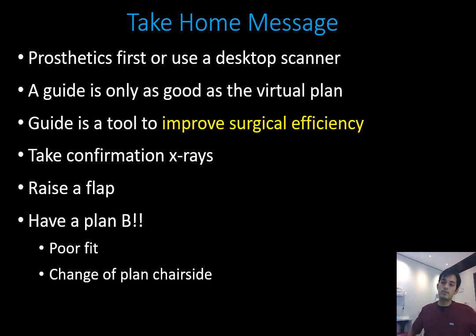Secondly, a guide is only as good as the virtual plan. Any shortcomings in your implant simulation or implant position from the plan will be translated into the clinical situation, especially in a fully guided approach. So your virtual plan has to be bulletproof. It really has to be done well for the guided case to come out well.